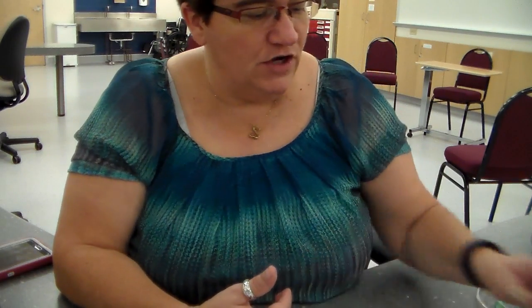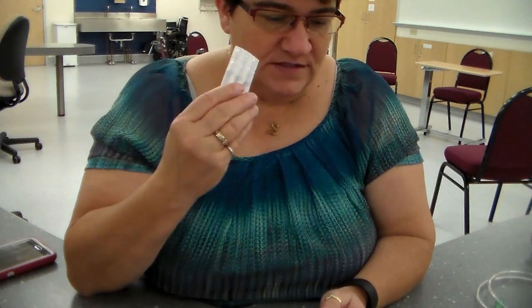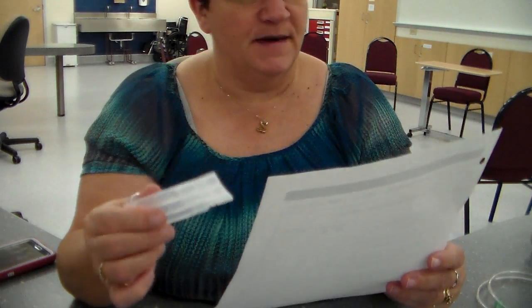You're going to go to the med room or wherever the medication is held, and get that medication. When you are taking it out of the med drawer or the location, you're going to look at the medication. You're going to say, yep, I have the right med, and yep, it's okay to use because it's not expired. Then you're going to check the medication label 3 times for safety. Once when it was taken from the drawer. You're going to compare it to the MAR and make sure I have the correct medication, the correct route, the correct time, the correct dose. And then you're going to check it again against the MAR when you get into the patient's room.